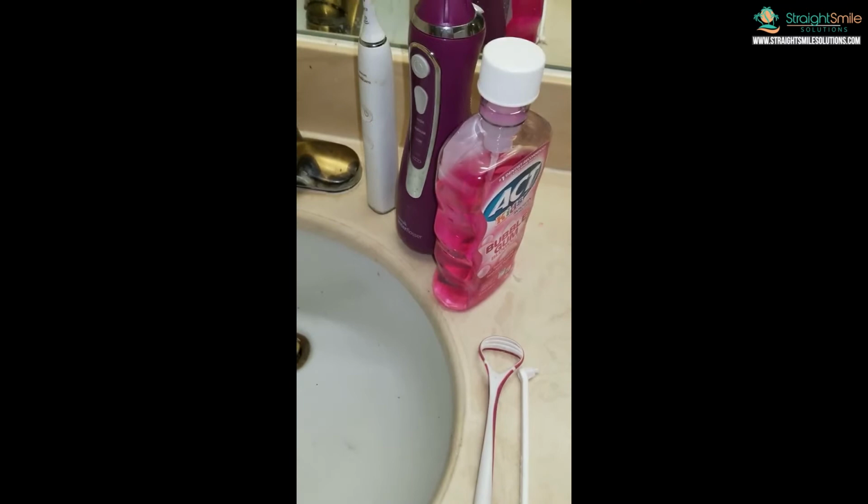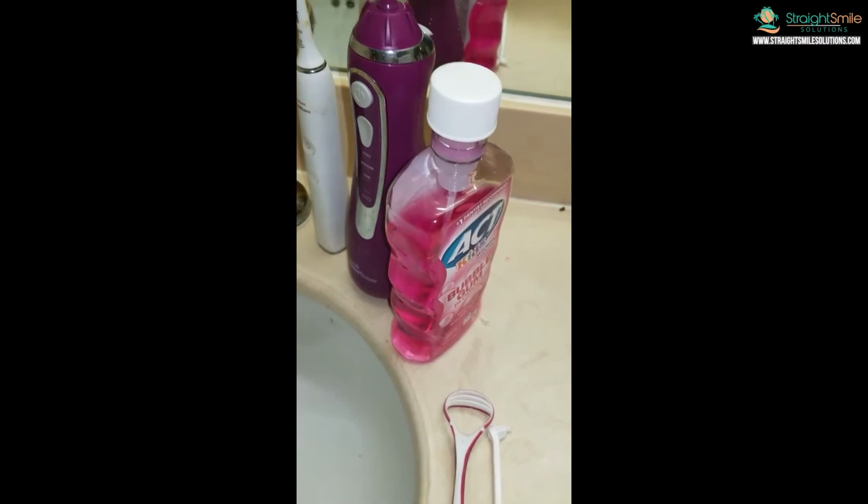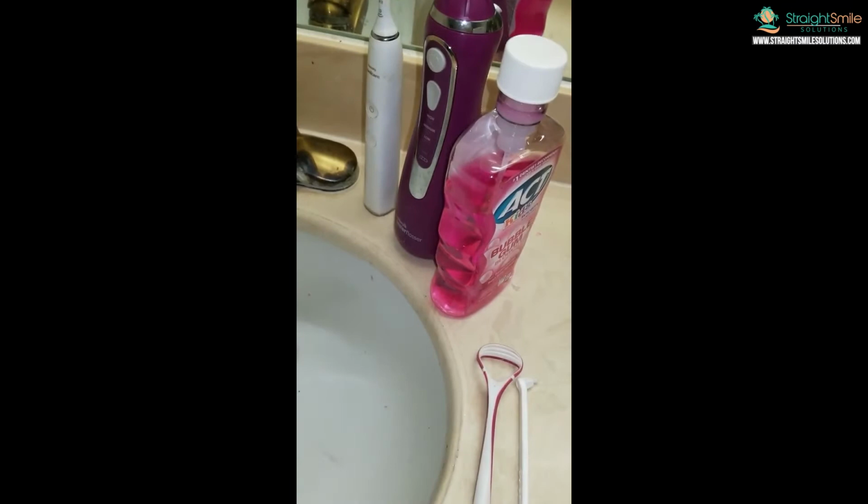Obviously, you're going to use your Sonicare twice a day for 2 minutes minimum. Your water pick, you can take into the shower with you and clean all your teeth and your aligners out if you have aligners. The mouthwash, you can actually dilute it and put it into your water pick. Tongue scraper should be done at least 2 times a day. And the itty bitty toothbrush to get all around those little aligners or inside your teeth. So hopefully that helps. These are the things I recommend.